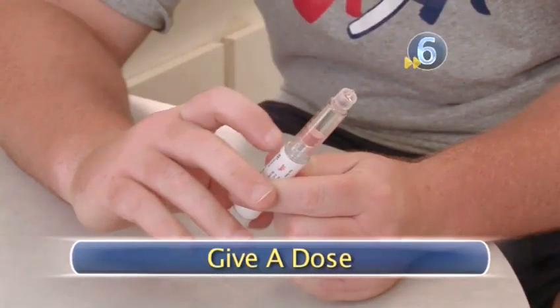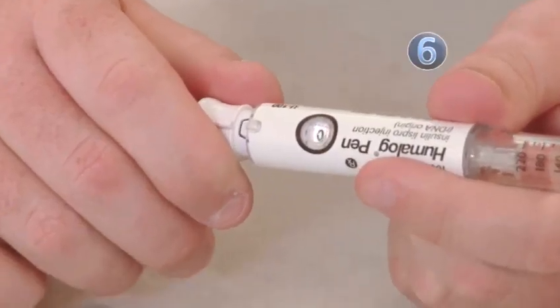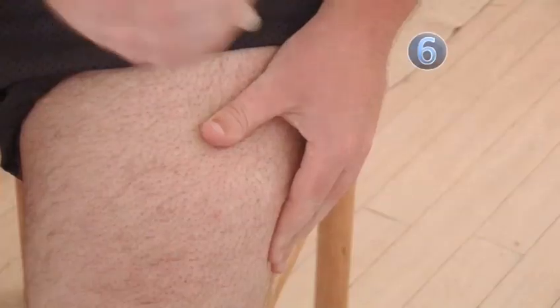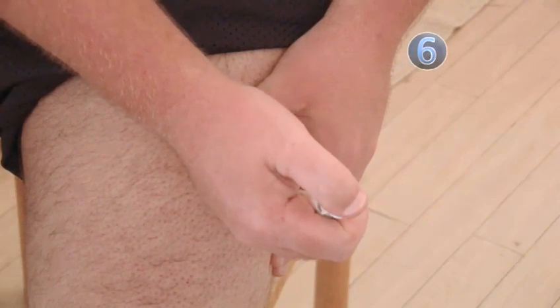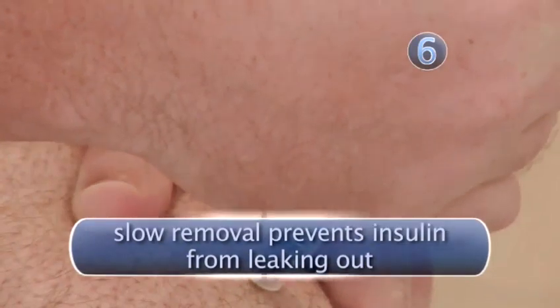Step 6. Give yourself a dose of your own medicine. Once again, return the dose knob to zero. Then, turn the dose knob to the number of units for your insulin dose. Pinch a bit of your skin and fat to ensure you are injecting into fatty tissue. Bring the syringe to a 90-degree angle over the area. Release tension on your pinch as you depress the plunger, then count slowly to 5 before removing the needle.